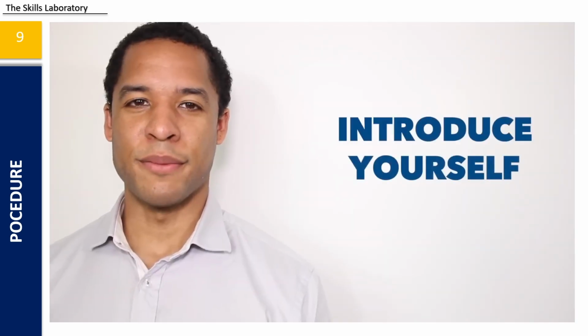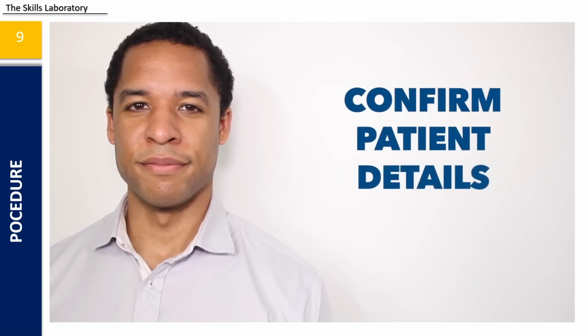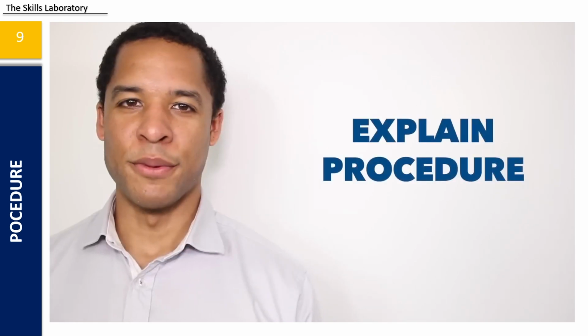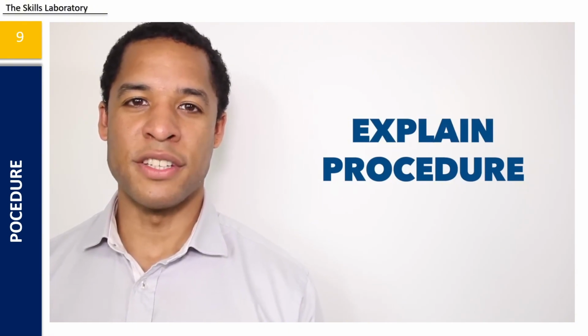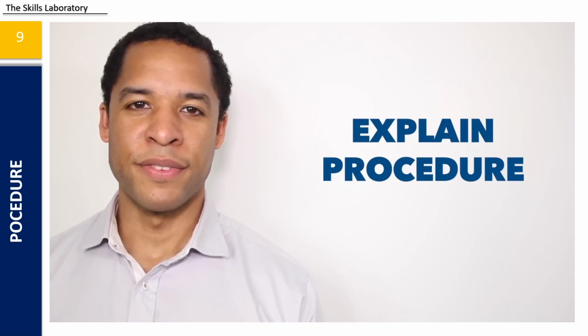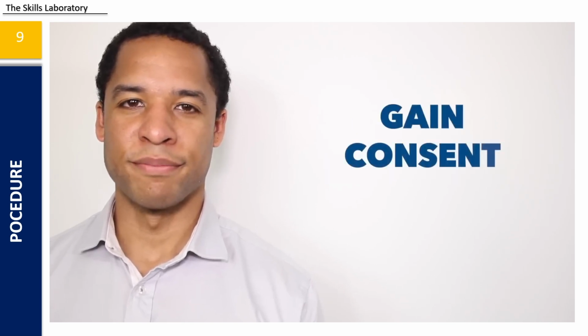Hi, my name's Adam. I'm a medical student. Can I take your name? Hi there, it's Lewis Potter. And what's your date of birth, Lewis? It's the 5th of the 9th, 1988. Okay. At the moment, you're unable to swallow food safely. Because of this, I'm going to insert a fine tube through your nose and into your stomach. It might be a little bit uncomfortable, but it shouldn't be too painful. If it does get too uncomfortable, let me know and we can stop. Are you okay for me to go ahead with the procedure? Yes, that sounds fine.